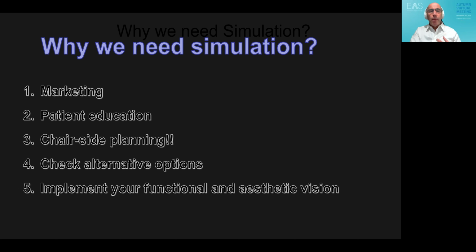I can also implement my functional and aesthetic vision. Don't forget that each one of us, each of the specialists around the world, each of the doctors, has a different perception of aesthetics. We have different experience on what is stable and what is not stable. So when we do the simulation, we implement what we think about this case. And this is probably the answer to those of you who say, okay, artificial intelligence actually is more clever than us because it suggests to us what to do.